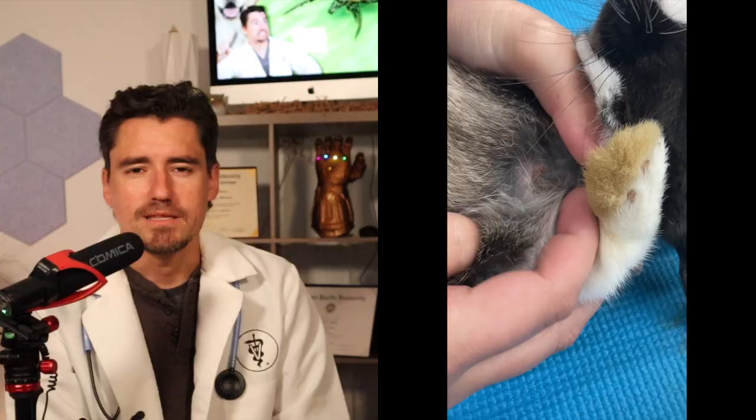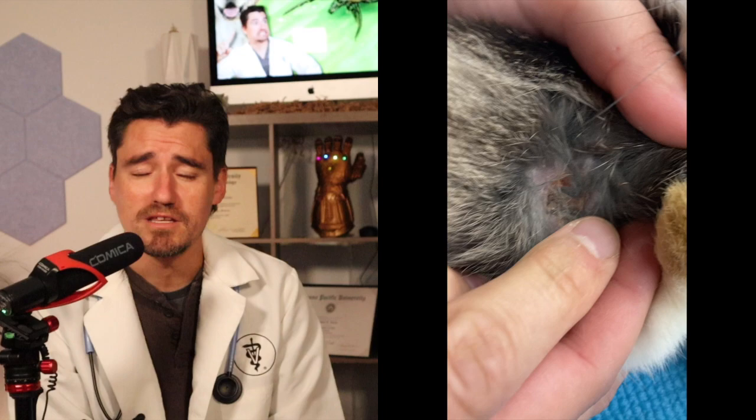This rabbit's gonna heal up beautifully after we clean and irrigate these infected areas. Once the bot fly's out, the rabbit heals super quick — and this rabbit did really well.